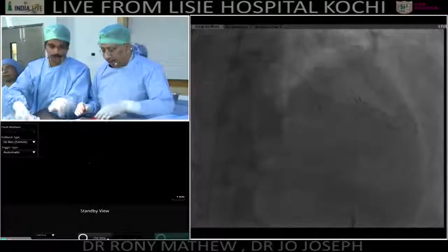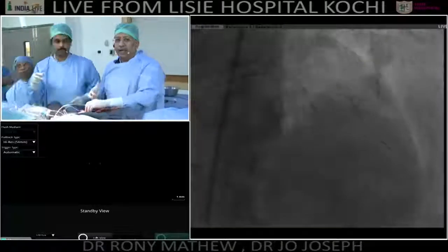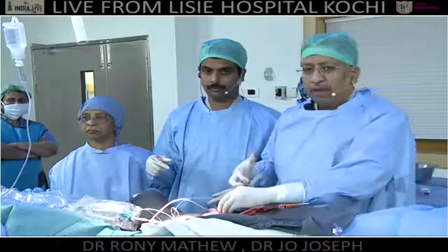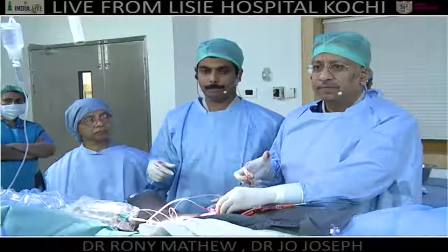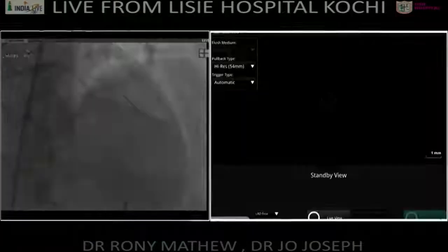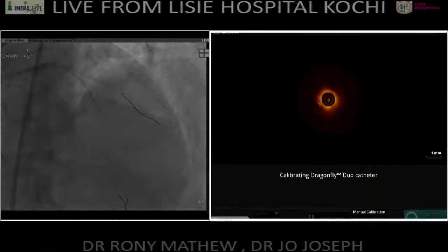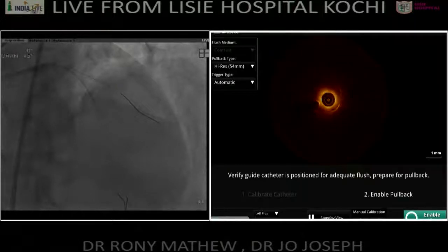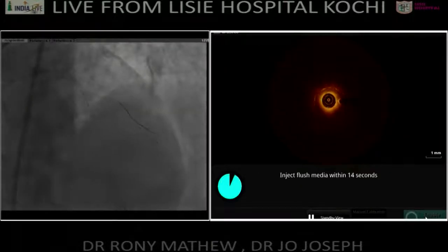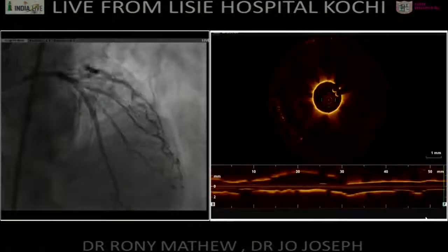All right, so there we are. We are ready with our OCT, if you see. Can you get me OCT and the fluoro side by side? Right, so now if you see, I go on to the live view. I calibrate the catheter. Once the catheter is calibrated, I enable pullback, and if you see the fluoro, the moment the contrast fills, it automatically does the pullback, and you can see the run.